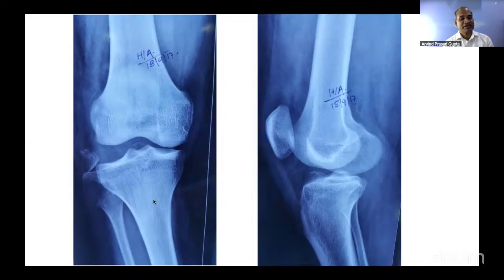So this again comes to planning: which investigation should we ask for after seeing such an X-ray? You should not just fix the fracture and think your job is done and the patient will be happy. After 2 or 3 months, this patient will come back to you again. Initially this was planned by another surgeon who said, "I'm going to fix this fracture and you will be fine."